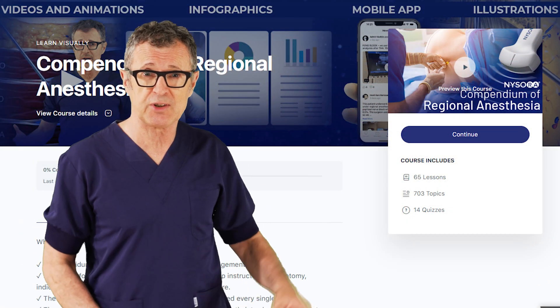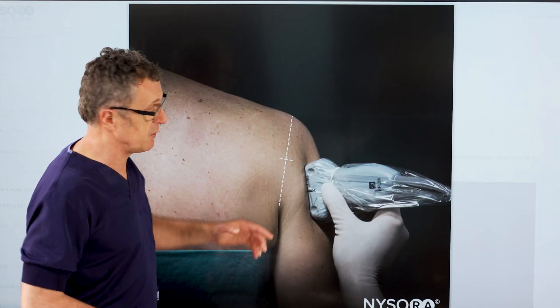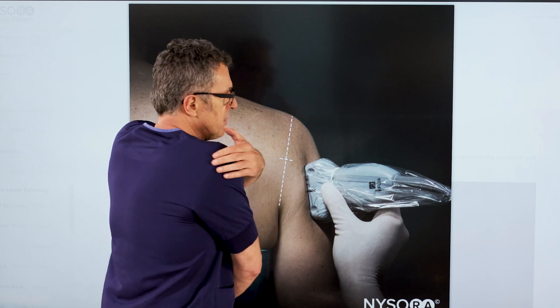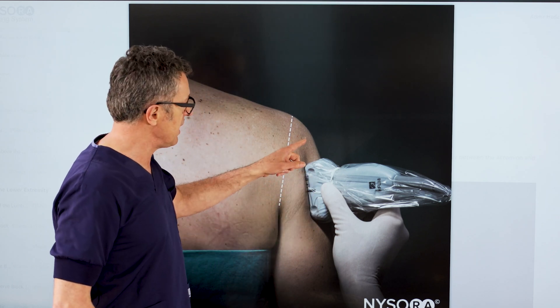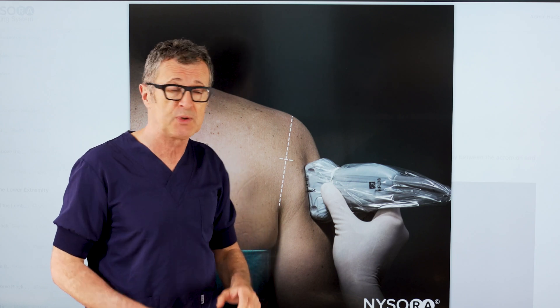Let's go to NYSORA's Compendium of Regional Anesthesia — axillary nerve block. Here we can see the position of the transducer for axillary nerve block. What you really want to do is place the transducer on the posterolateral aspect of the shoulder. You want to see the head of the humerus and scan down slightly distally until you just lose the head of the humerus.